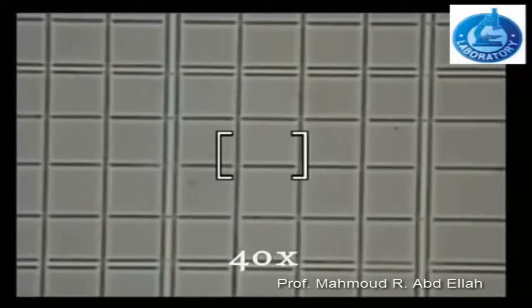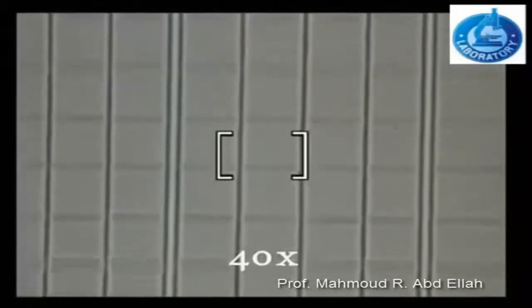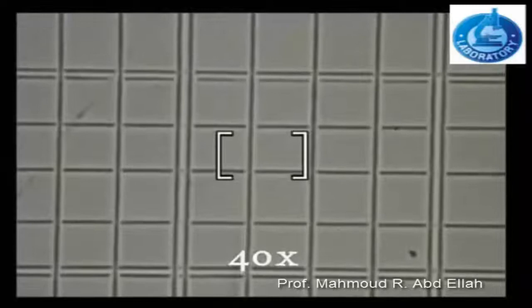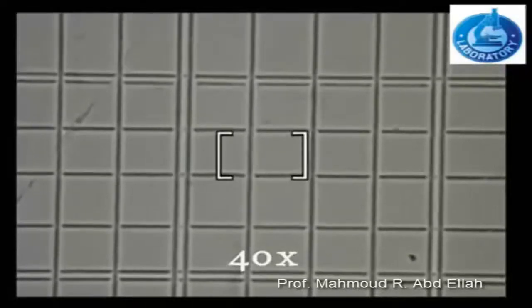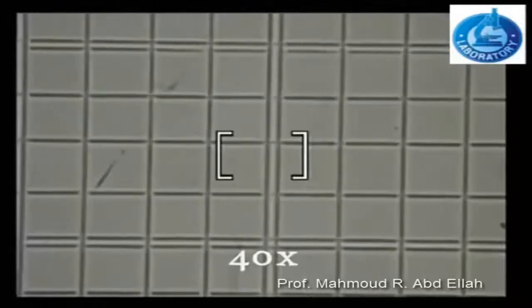In the case of red blood cells, only 5 squares are selected for counting: 4 of them are located at the periphery of the central area and 1 square at the center.